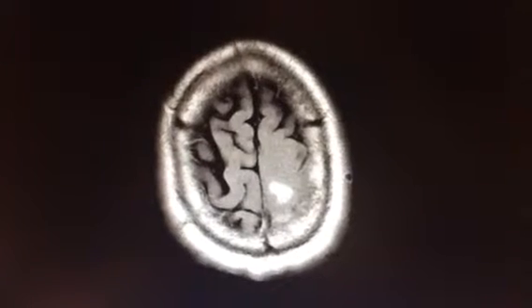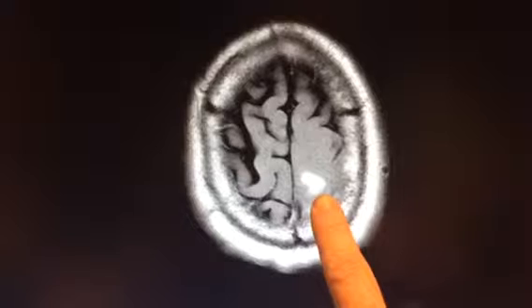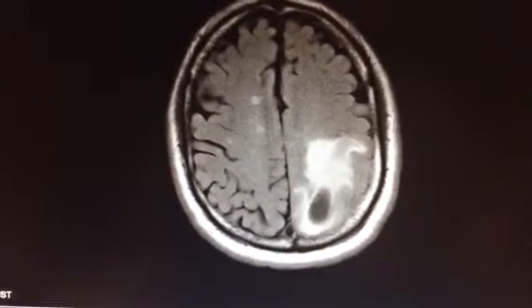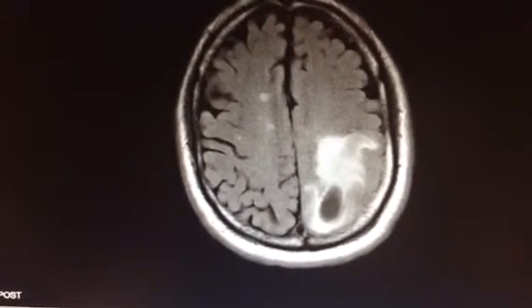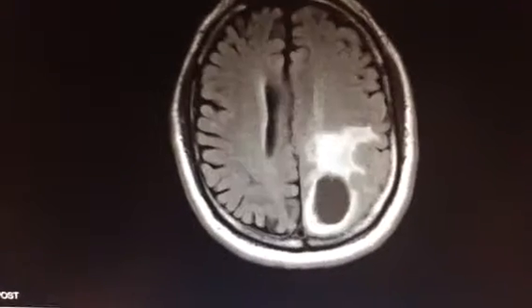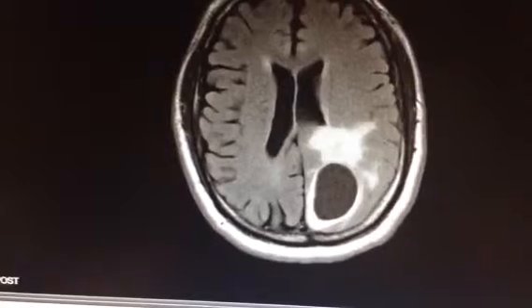Then the very first slide where you see brain tissue, this right here is not the cyst, this is swelling from the cyst. Another slide down, you're still seeing swelling, and that swelling is pretty severe. Larger yet again, still swelling as we're going down into the head. That dark area is the start of the tumor. When you see dark on this image, that indicates fluid. And so there's the cyst. You can start to barely see the tumor right there.